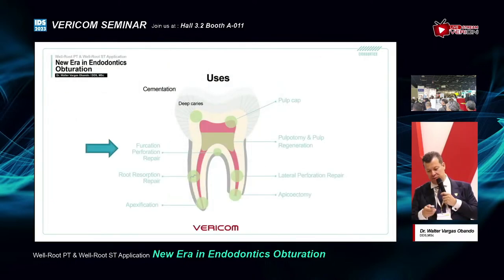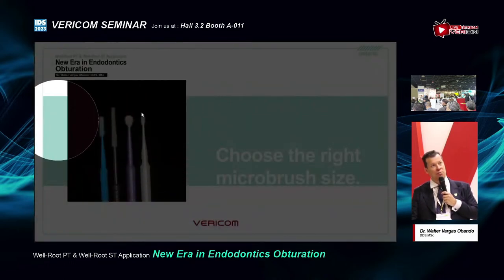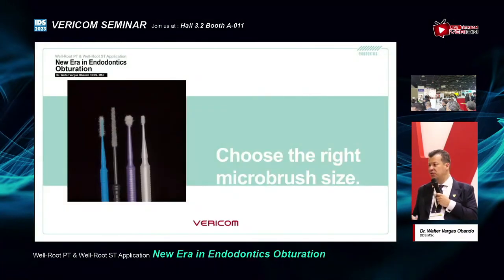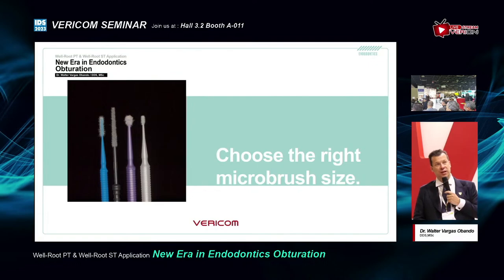Right now, we have really good materials in our offices. Remember, always have many of those. They will help you a lot of the time. The thing is, they are really cheap. You don't need to spend a lot of money on these things, and that will help you a lot to manage the bioceramic sealers.